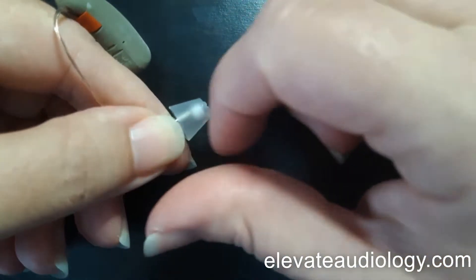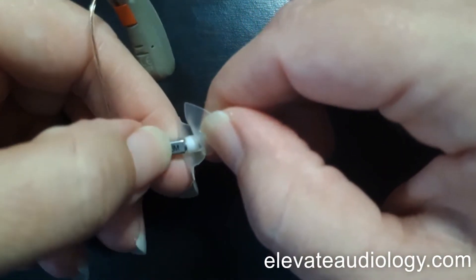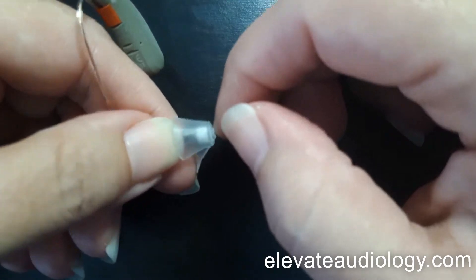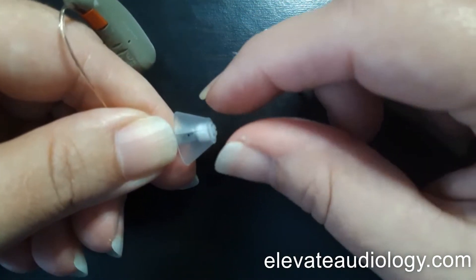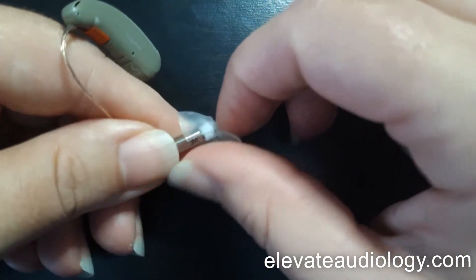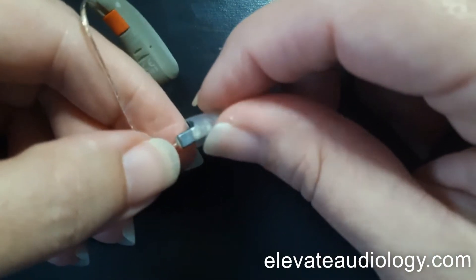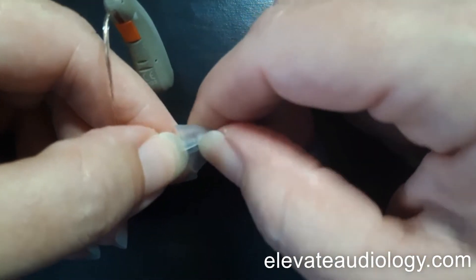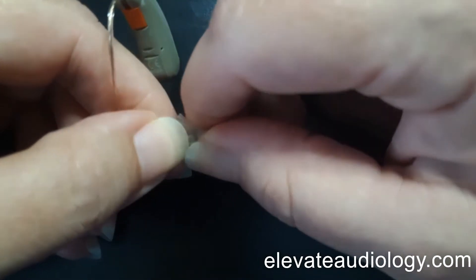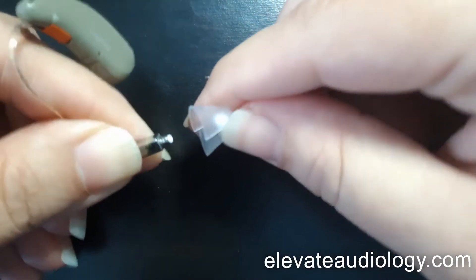So in order to change it, you have to actually remove the dome by this collar here, and it takes a little bit of effort. It doesn't matter if you have a tulip style, an open, or a closed style dome — it all works the same way. You've got to get your fingernail underneath the click part. Hold the receiver piece with one hand, and with the other, use your nail underneath it or grab the white collar and disconnect that part.